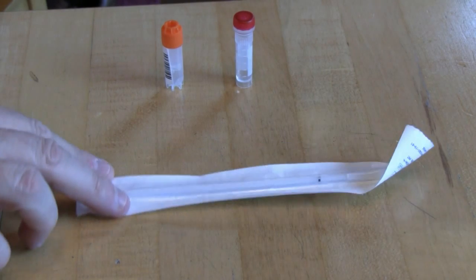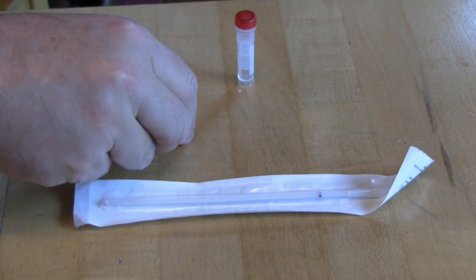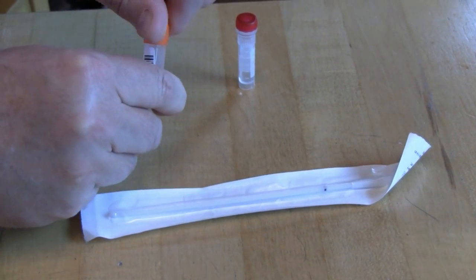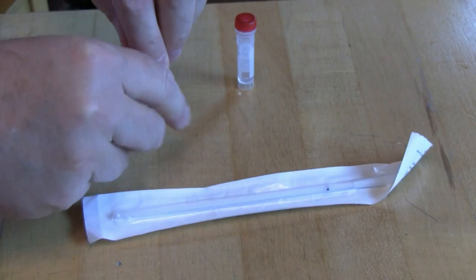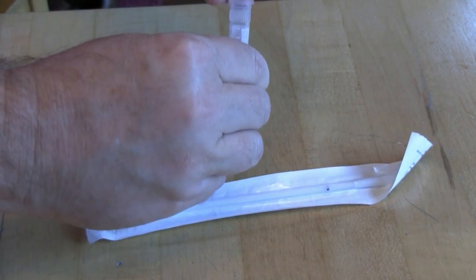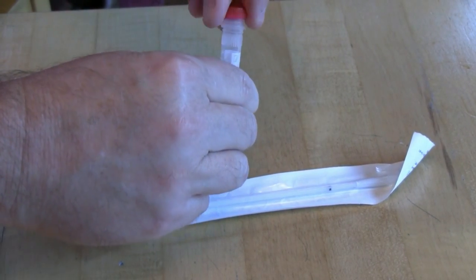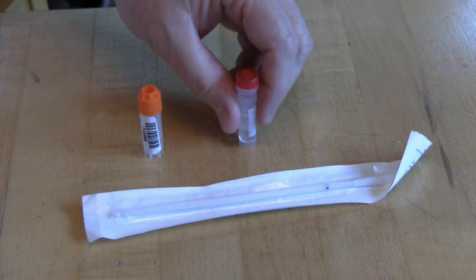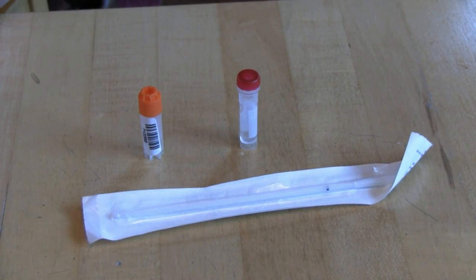Looking at the materials again, you've got your swabs. You could have a newer orange vial that screws off, or you could have a red style screw-off vial. If you have the type of vials that are attached to the top, that's an older style and you should see a different instructional video.